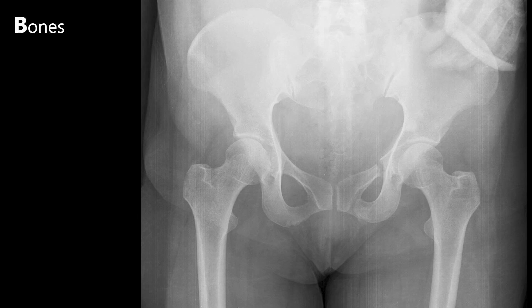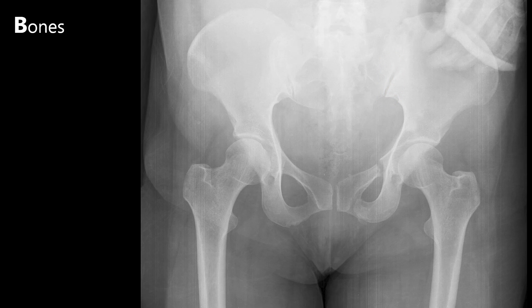Moving onto the pelvis, this x-ray shows a fracture in the superior and inferior pubic rami. These fractures occur together, as the pubis is a rigid structure, so one rami cannot break without the other. Notice here the asymmetry between the two obturator foramina. This patient also has diastasis of the left sacroiliac joint as a result of these pelvic fractures. Pubic rami fractures are also typically caused by falls in patients with osteoporosis.